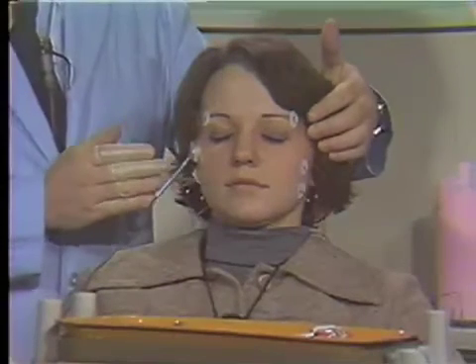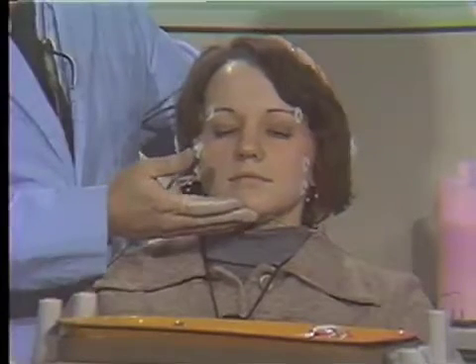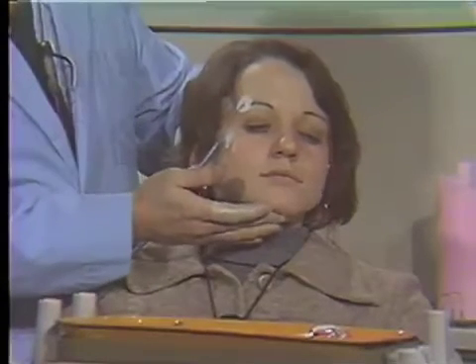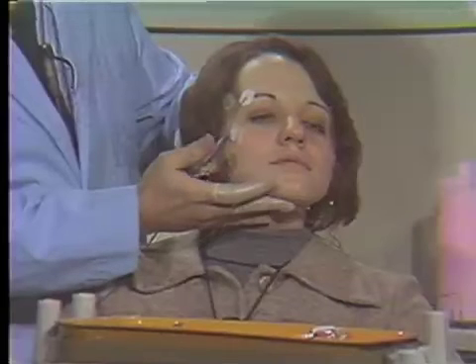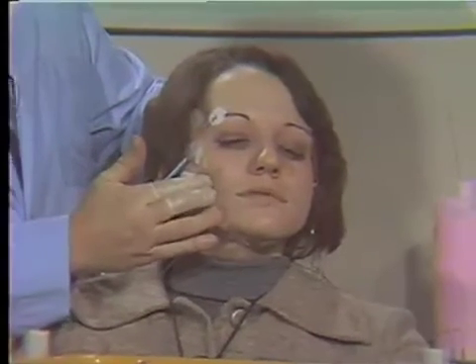As you have already learned, the first thing to do is palpations. We'll just palpate the right side. First of all, put your chin up and we go for the digastric muscles. And you'll notice this is where we put our digastric electrodes. The next is masseters — this is where we put our masseter electrodes.